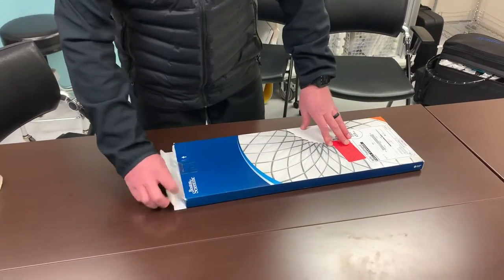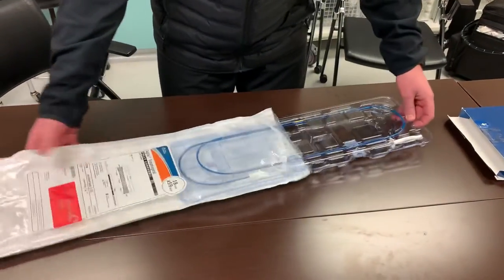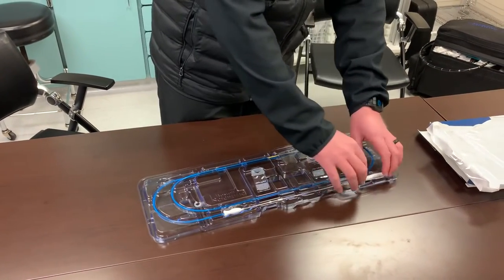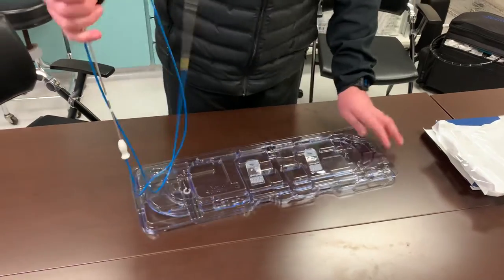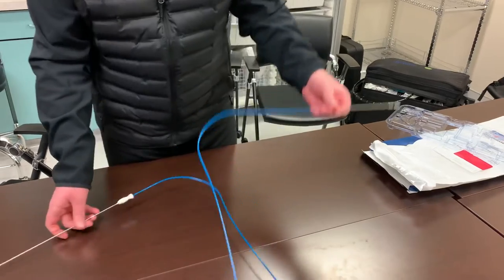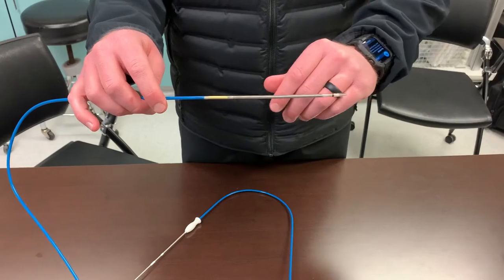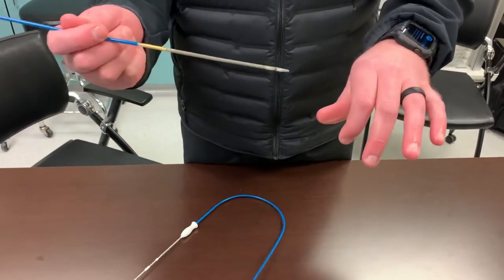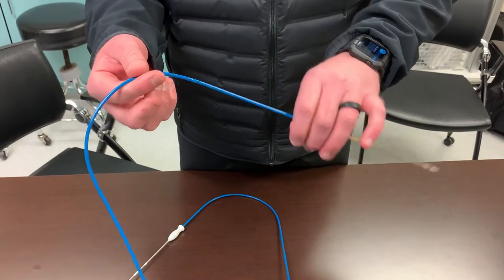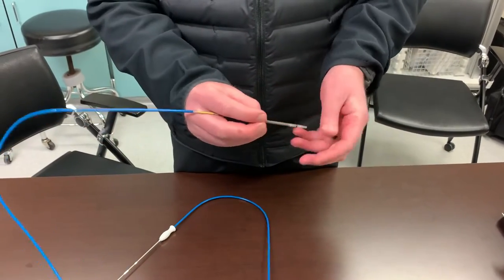When you open the package, inside you'll find more packaging — inside that is the wrapping for the stent. The stent can be removed from the packaging. A small amount of lubrication will be applied to the outside of the catheter. This catheter will be sent directly down the biopsy port — the larger of the two channels. As the stent is sent down the scope, eventually the tip of the stent will exit the scope.